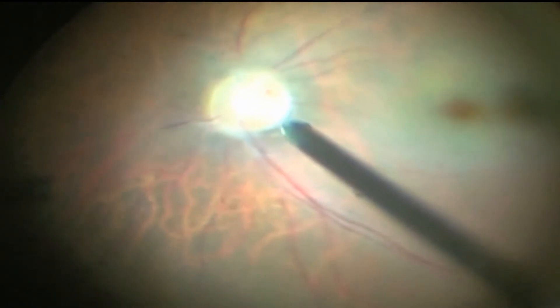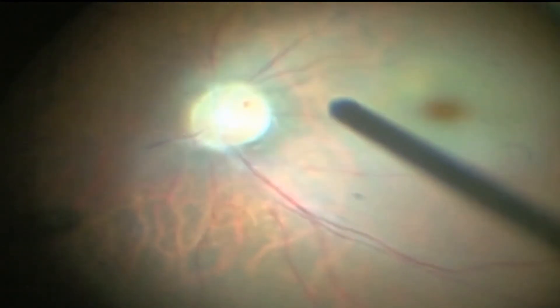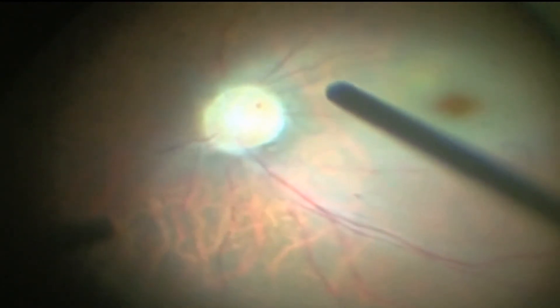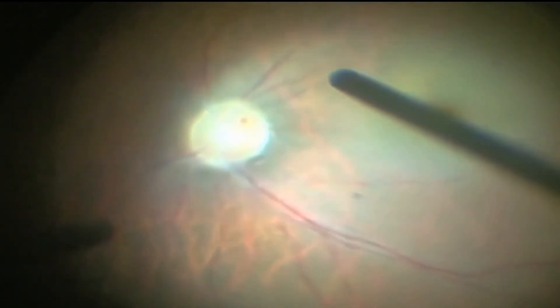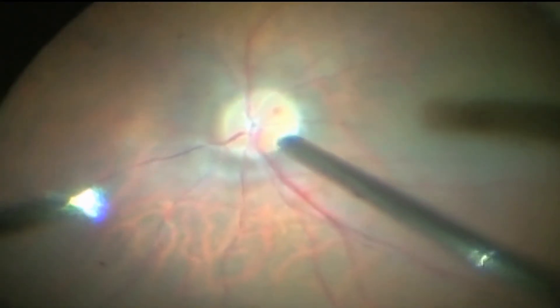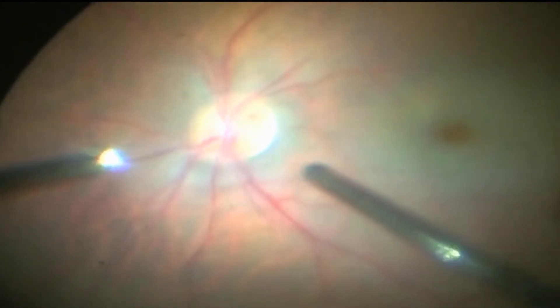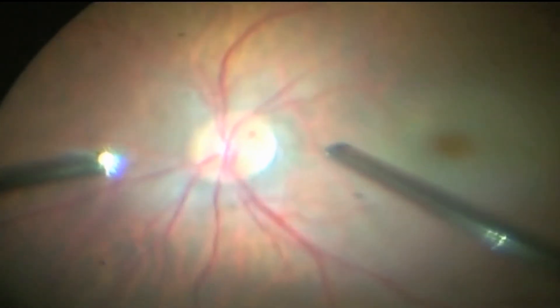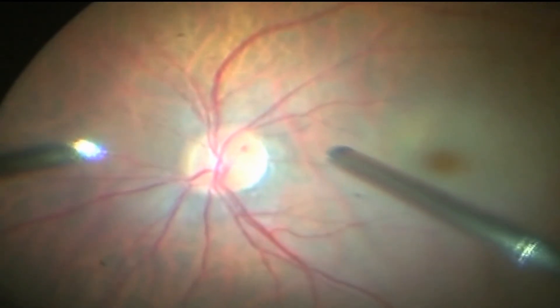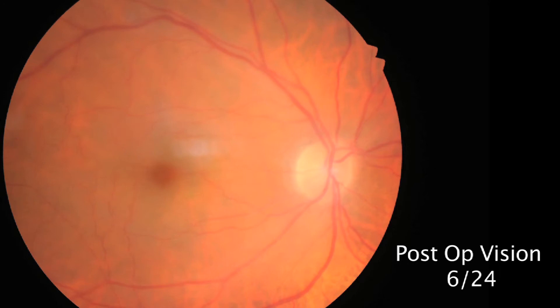Once the glial tissue has been dissected, one has to wait patiently for a few seconds. The disc then begins to show signs of reperfusion in the form of small hemorrhages on it, and then the central retinal artery pulsates back to life. The perfusion was restored almost immediately. Post-operatively, he recovered 6/24 vision.